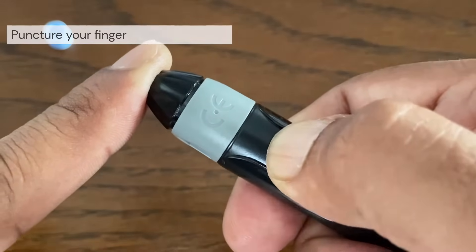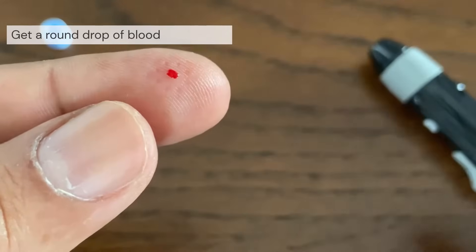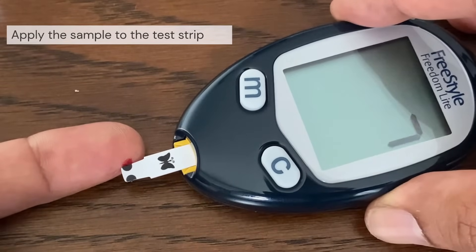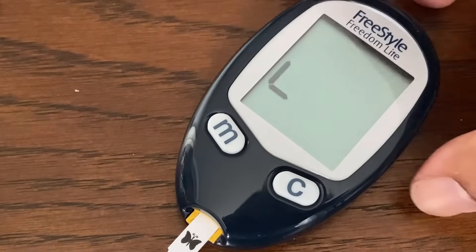Gently squeeze and massage your fingertip until a round drop of blood forms. You can apply blood to either side of the test strip. Apply your sample to the opening of the channel. Holding the meter at a slight angle, guide the channel to the blood drop. When it touches your sample, the test strip wicks blood into the channel. The channel should fill completely.